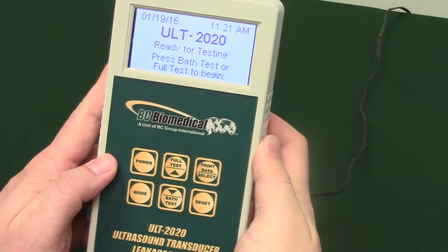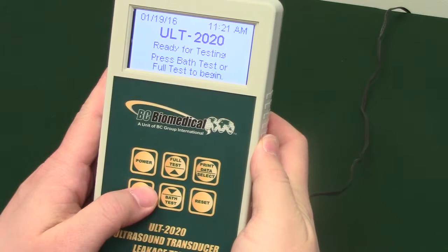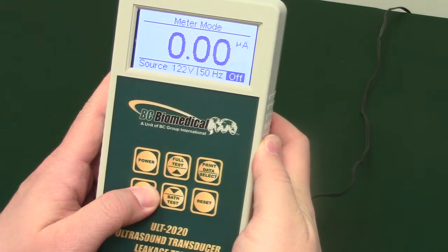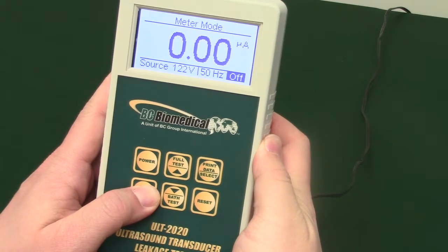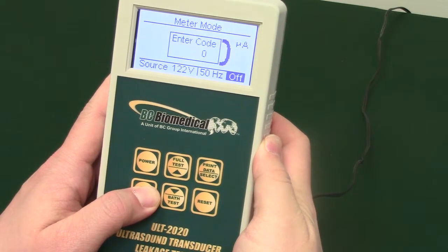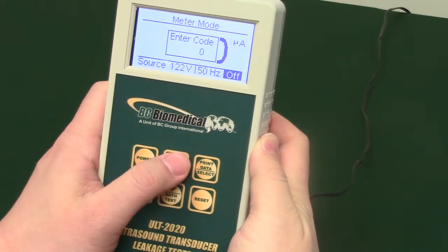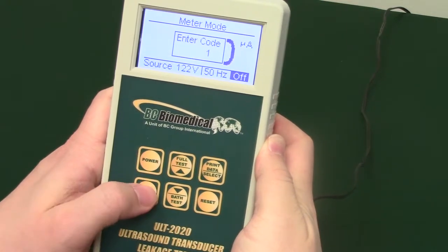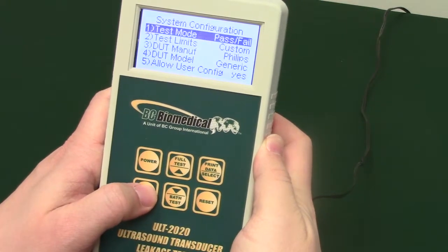You can also adjust the system settings. To access the system settings, hold mode for 5 seconds until 'enter code' appears. Use arrows to scroll to 1 or your set password.